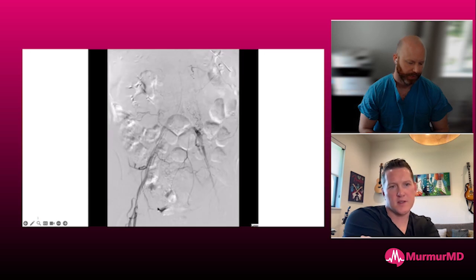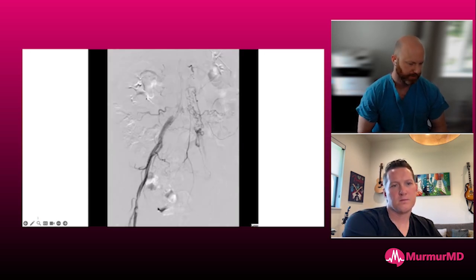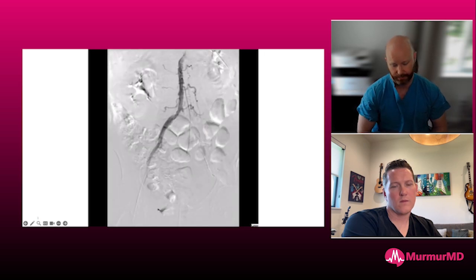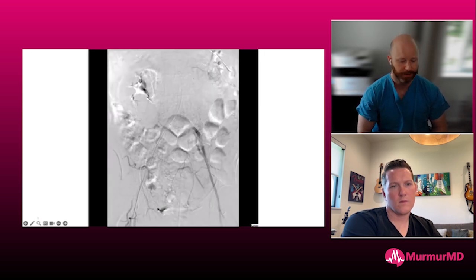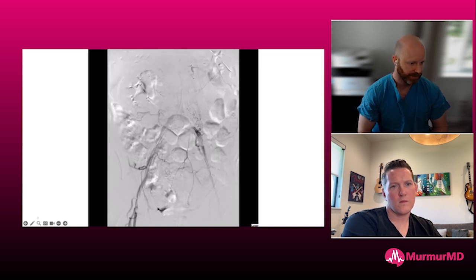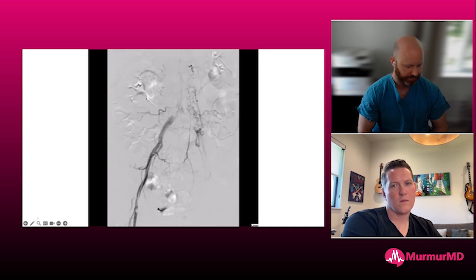Because I don't think we talk about this a lot, but so you've got the Impella in, how do you decide? We do something, I think, a little unique in that we actually set up the LVEDP on the device, which almost nobody does, and then we track that to the end of the case. Other people do things like right heart catheterization and then a repeat right heart cath, which I think is totally reasonable. We just think that it's a little bit easier to set up the LVEDP on the Impella itself to start, and then be able to monitor that throughout the case.